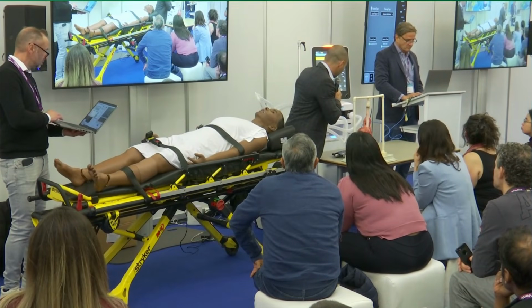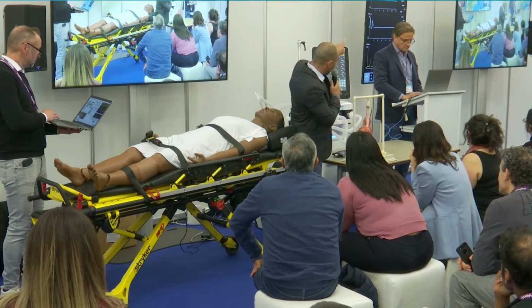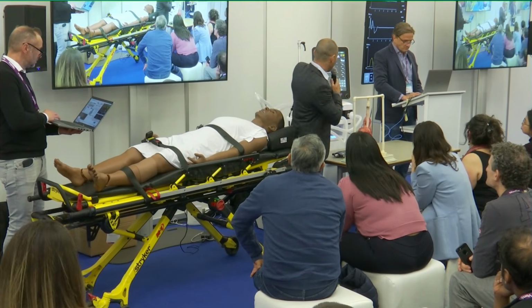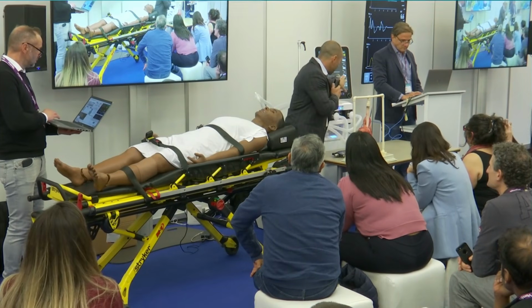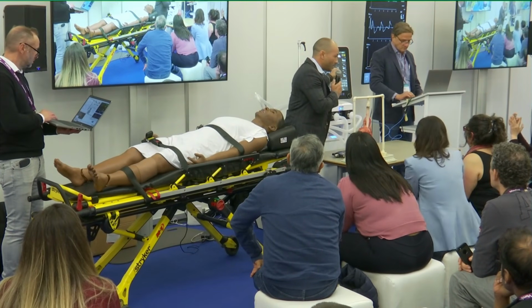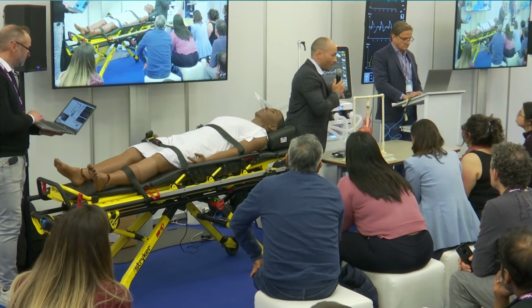Thanks for coming. So I connect the vent to the patient. On that screen, you can see our main screen here. As you can see, on the right lower corner, we have some applications, okay?